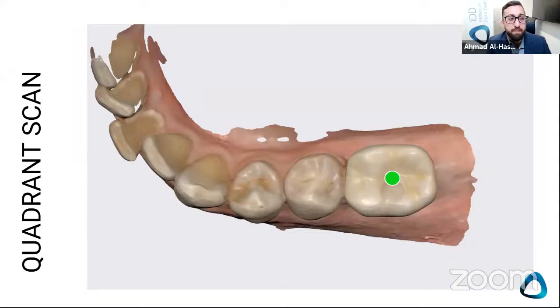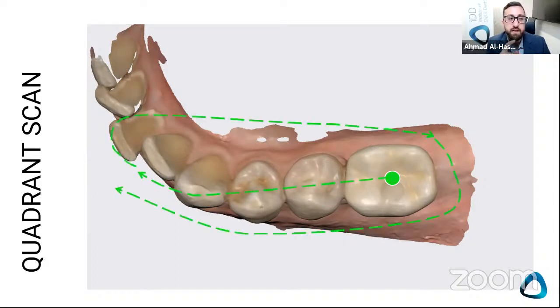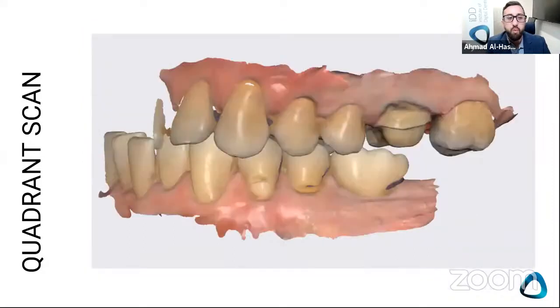As you can see, up to the canine or a bit further, on the opposing arch, you scan the occlusal, you move to the front, and then you wrap around. You move to the lingual, and then you move to the palatal. When you take a bite, this is how it looks.